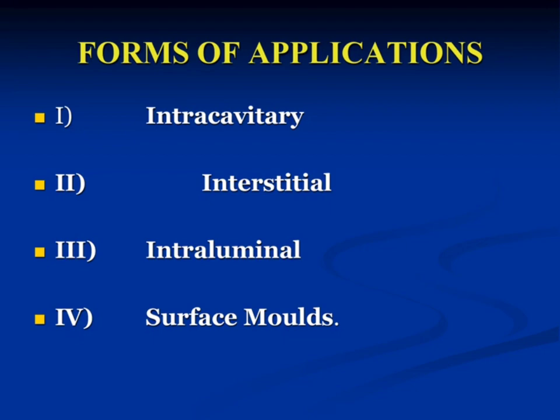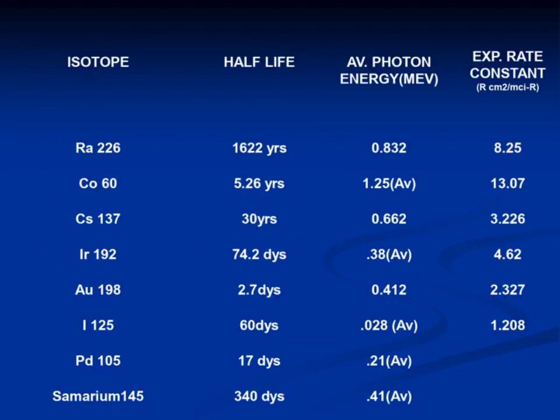The surface mold portion is directly hit by the electron mode of the LINAC treatment, so it is in direct confrontation and competition with the linear accelerator: electron versus surface mold.